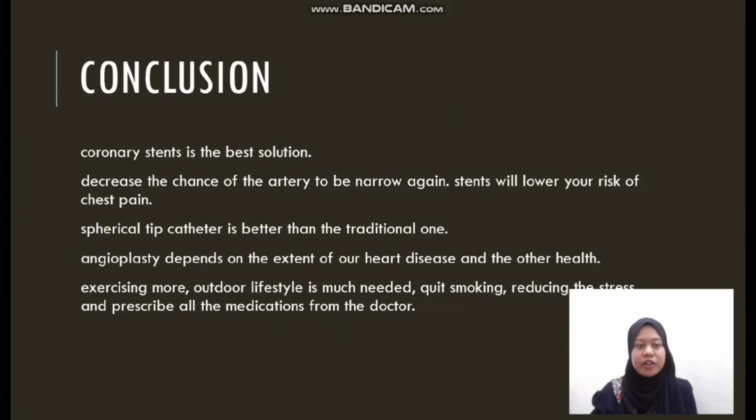In conclusion, coronary stents are the best solution in order to decrease the chance of the artery becoming narrow again. The stent that is left behind will reduce the risk of chest pain. In addition, the spherical tip catheter is better than the traditional one. Other than that, patients need to note that the angioplasty procedure depends on the extent of the patient's heart disease and other health conditions. Not every patient is suitable for this procedure.